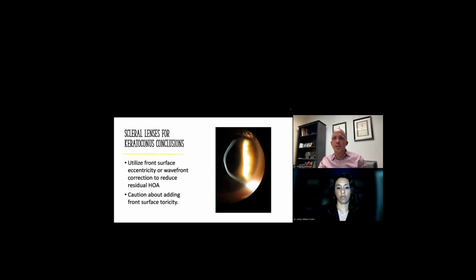The studies are kind of all over the place right now, and the funny thing about wavefront correction is it's not 2 + 2 = 4. It's really 2 + 2 = 6.7. And it can really stump you sometimes. And of course, I presented a lot of home run cases, strike cases. I have plenty of gutters too. And so it doesn't always work like you'd think. And sometimes we just really have no idea why.